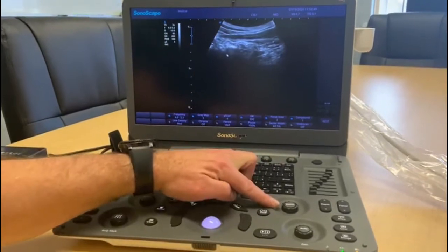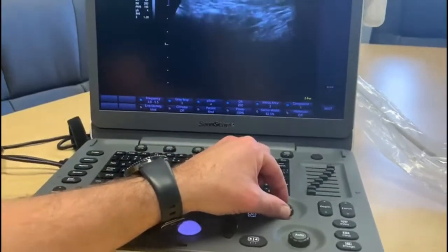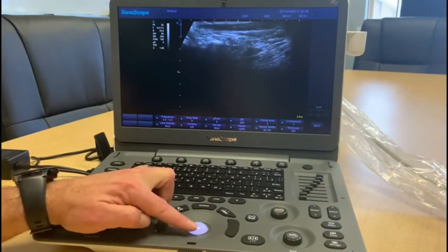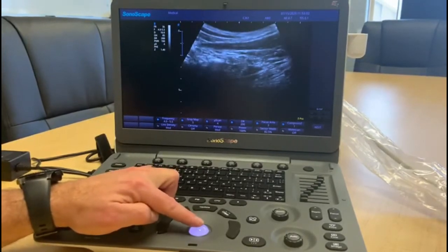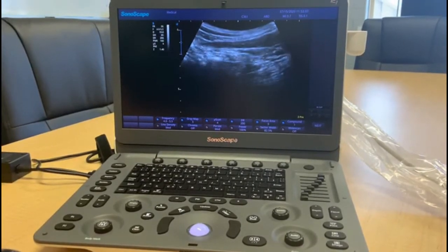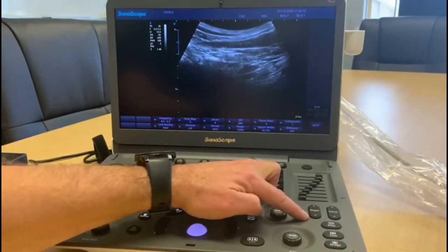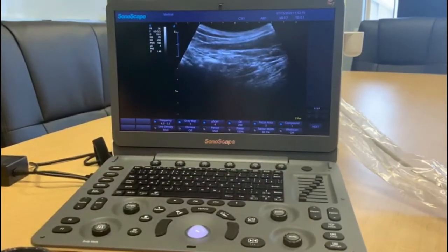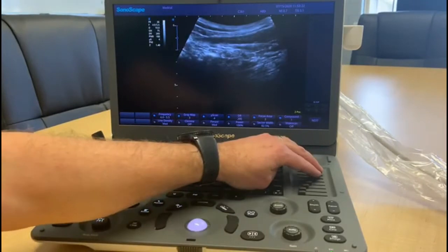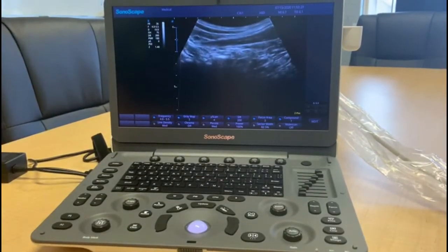The next feature is the zoom, which is just here — it zooms in as you'd expect. You'll see we've lost a little bit of the position of the image, and we can use the trackball to move the image back into the main area of the screen. We do tend to lose a bit of clarity with zoom, so you're probably better off using depth to get a bigger screen. You may need to play around with the gains to bring in the blacks and whites and get a clearer picture.